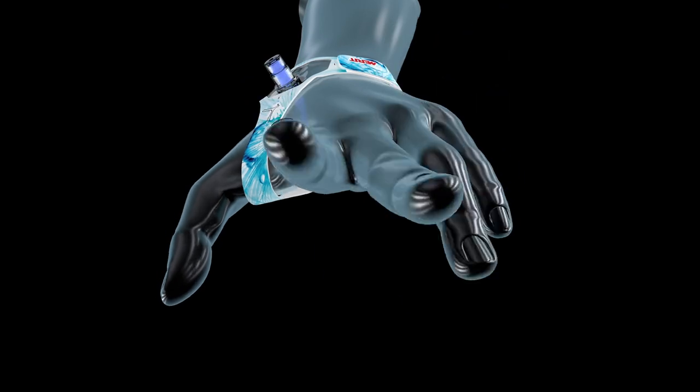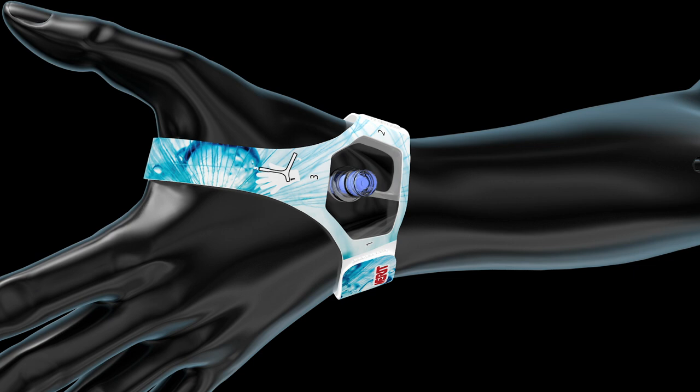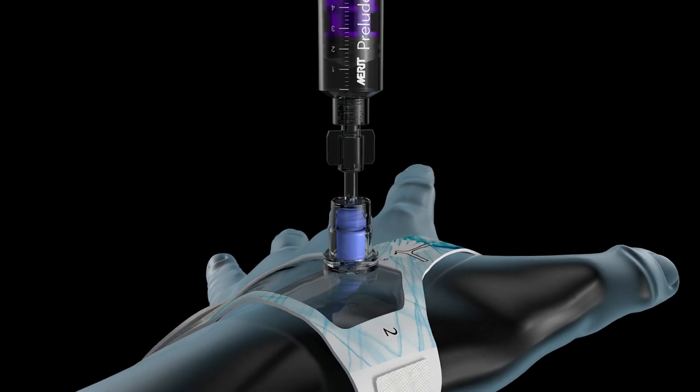After you remove the syringe, your patient should be able to move their hand and wrist freely without any bleeding. If you observe bleeding, inject additional air into the balloon until bleeding stops while maintaining adequate distal perfusion.